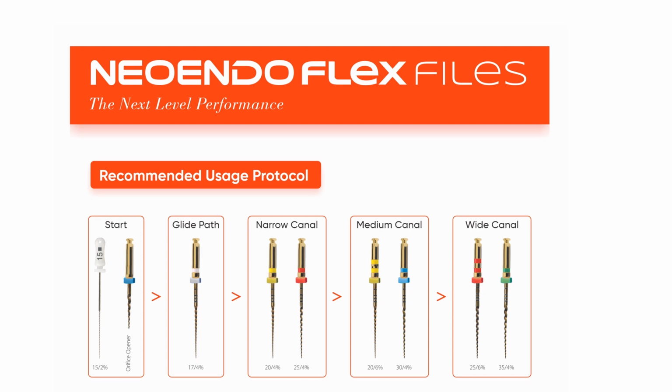So here also in the NeoEndo Flex file system, you have to use your number 15 K file, and then you use their orifice opener. This one is the orifice opener, and there is no colored band present over the orifice opener. Then you can use your glide path files. This file system comes with a glide path file of its own. Otherwise you can use the glide path files of ProTaper from Dentsply, the ProGliders. But this NeoEndo system has its own glide path file which has a tip diameter of 17 and a constant taper of 4%.